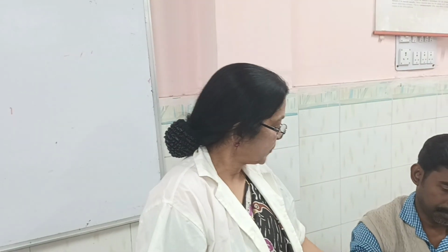Then, by the palpatory method, we are avoiding the auscultatory gap. This is the most important thing. What is the auscultatory gap? Any phase of the Korotkoff sounds may remain silent. That phase is known as the auscultatory gap. It happens in hypertensive patients, cause not known. If you do not do the palpatory method and go for the auscultatory method first, what happens? First, you may not be able to hear the tap sound. It is not audible. And the murmuring period remains silent. Then the first gong will appear as the tap.